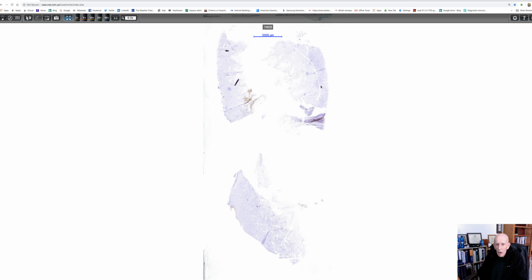So just to summarize, we've got a lesion, I think, on the leg. It's porocarcinoma by virtue of its mitotic activity and its deep growth pattern. It's not a pleomorphic example. Porocarcinoma, to my mind, is one of the more common high-grade sweat gland carcinomas.